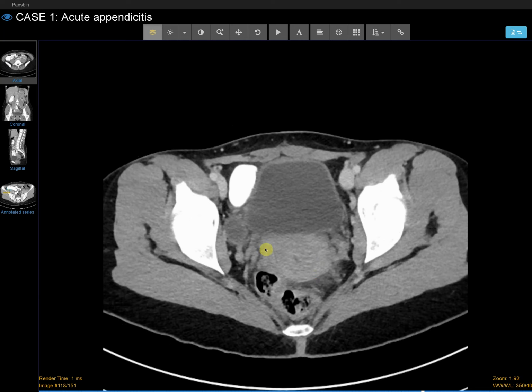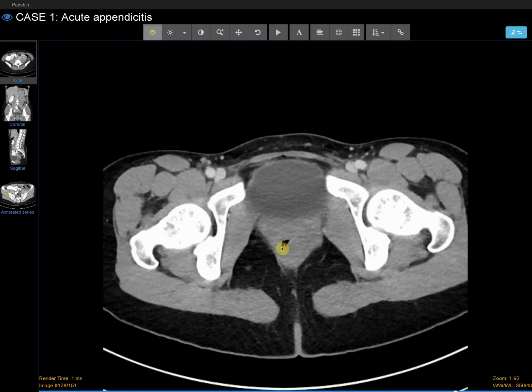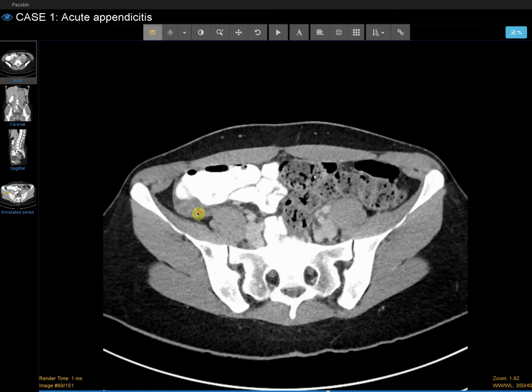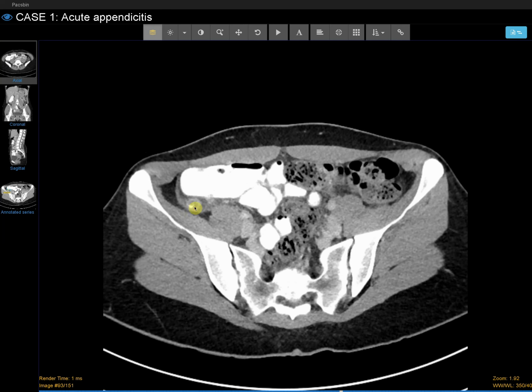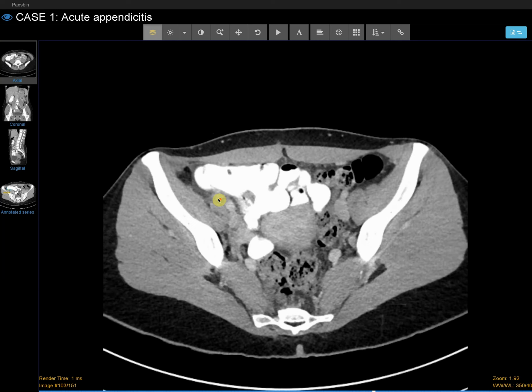This is a female, and this is her uterus. And we do have ascites. Once I go down like this, I know that the area I need to pay attention to is this general area, because I noticed something abnormal. So let's see. I have something long and tubular right here. It seems like an appendix. There's something bright, which I would suspect is appendicolith. Let's try to follow it to see if I can track it down to the cecum.